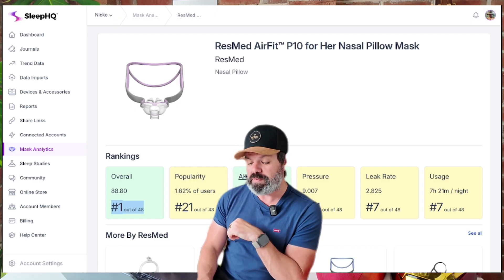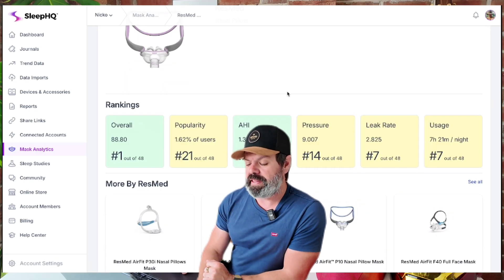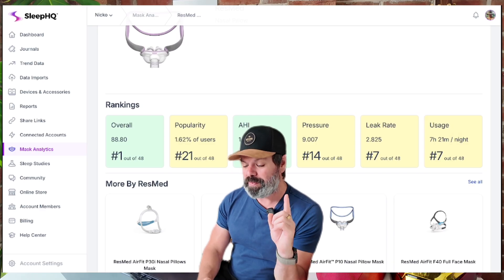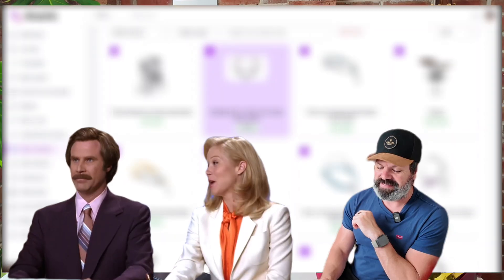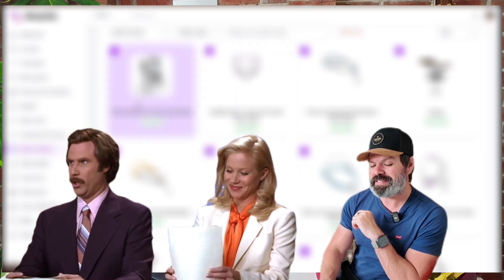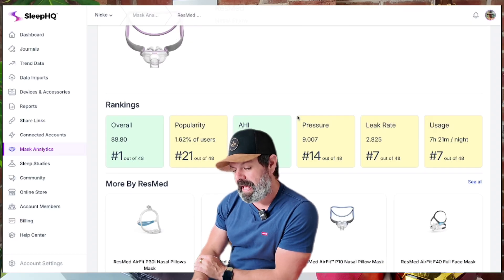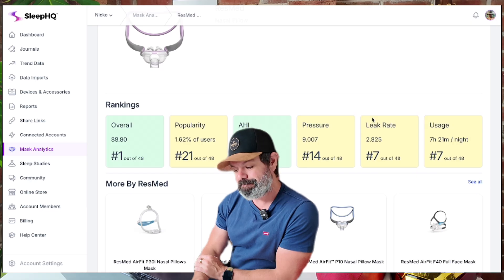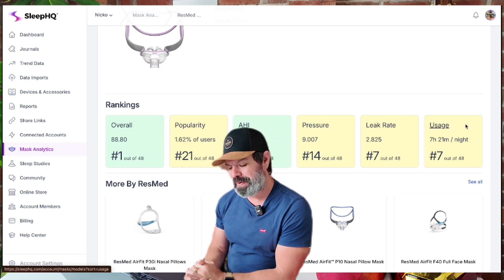Average AHI for this mask — check that out — 1.386, and that is number two. If we want to check out the number one spot, you can just tap on AHI. Average pressure is nine, average leak rate 2.825 liters per minute, and average usage seven hours and 21 minutes per night.